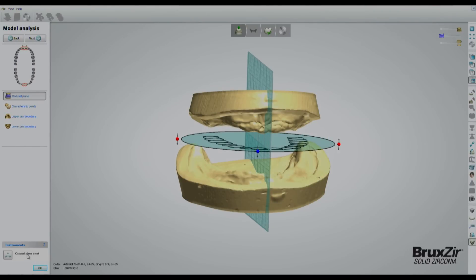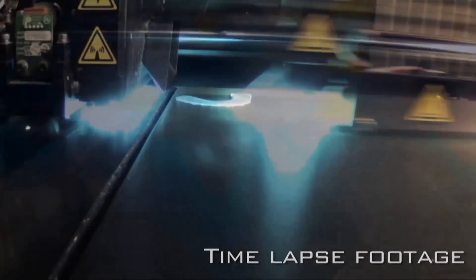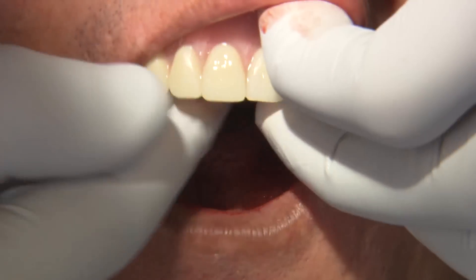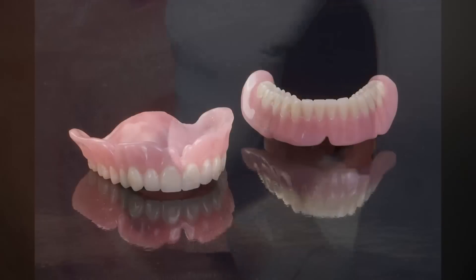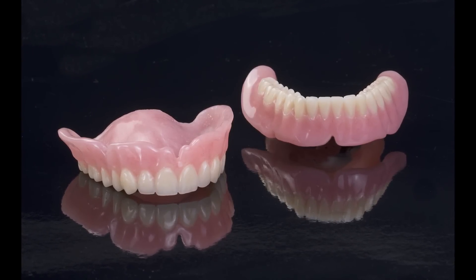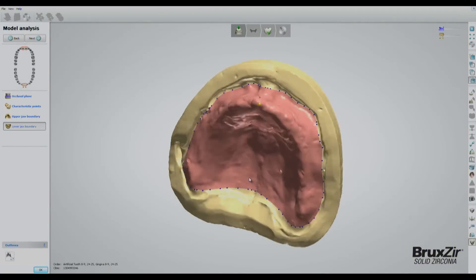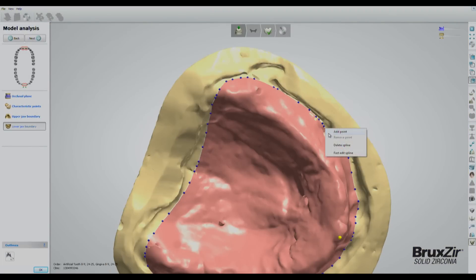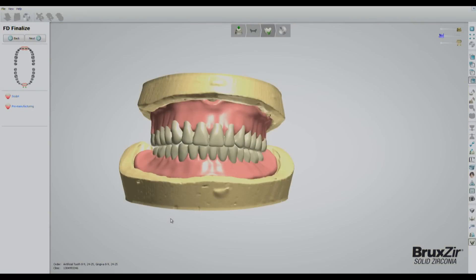Fabricating dentures with CAD-CAM design and 3D printing saves you time, money, and resources, and can help you experience smoother try-in and delivery appointments. First, we take the scanned model of the patient's dentureless arch and use CAD-CAM software to digitally fine-tune the design of the denture.